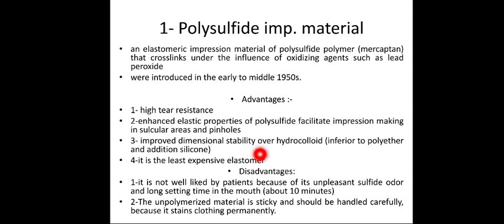The dimensional stability is better than hydrocolloid, better than the alginate, and it is cheap, least expensive material. The disadvantages is the bad odor of sulfide material and the stickiness of the material that make it messy and stain the clothing and the patient's skin.